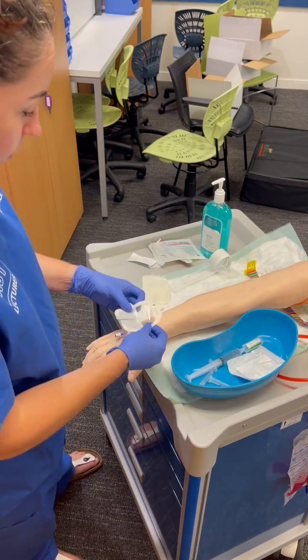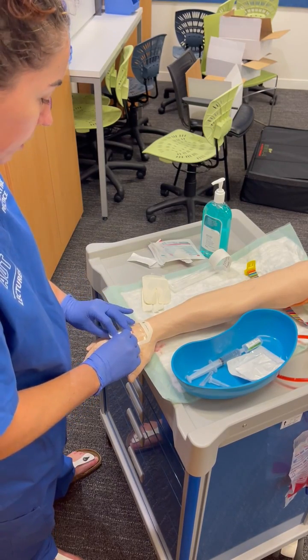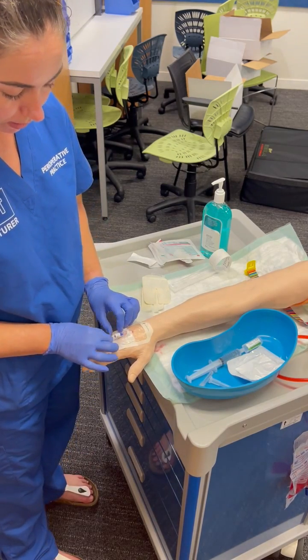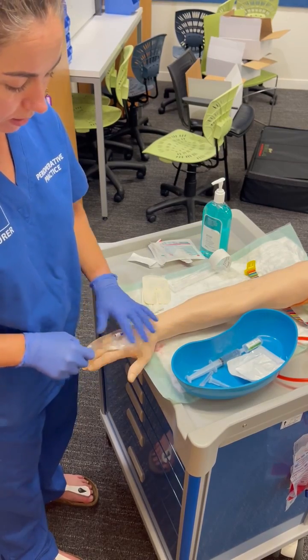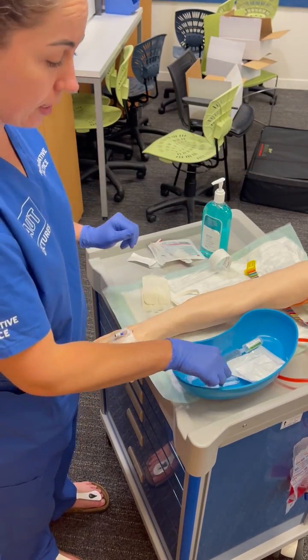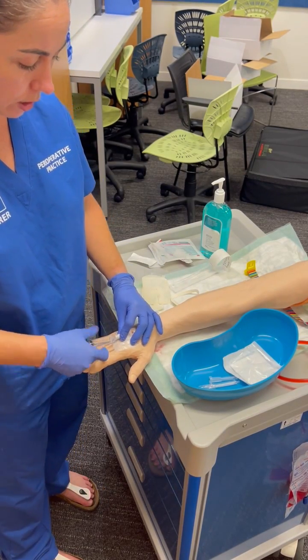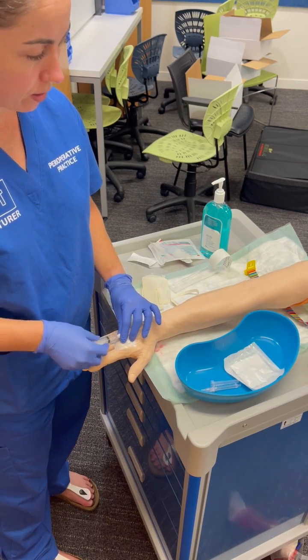As I said in the last video, the specific order of things can be a bit flexible. But the main points are your aseptic technique and your sharps safety. My sharps bin is just down the end of the room so I've left it sharp in my tray. I'm going to attach my syringe and give it a flush. Looking really good.